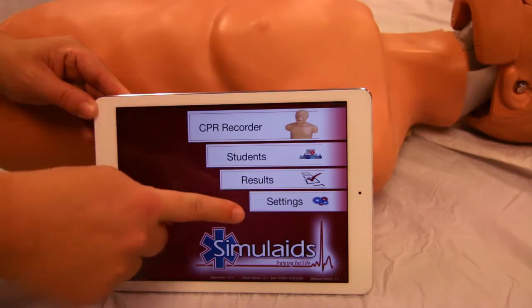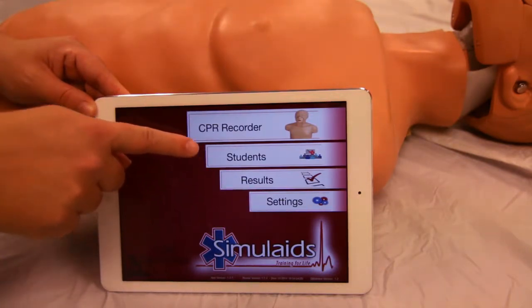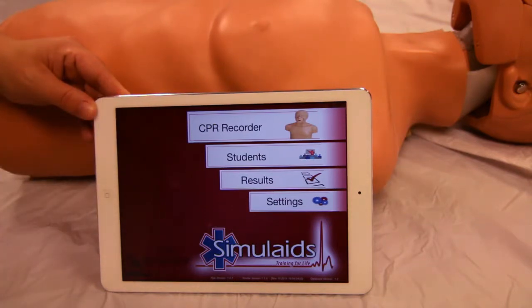Key functions include: settings, results, students, and simulator controls.